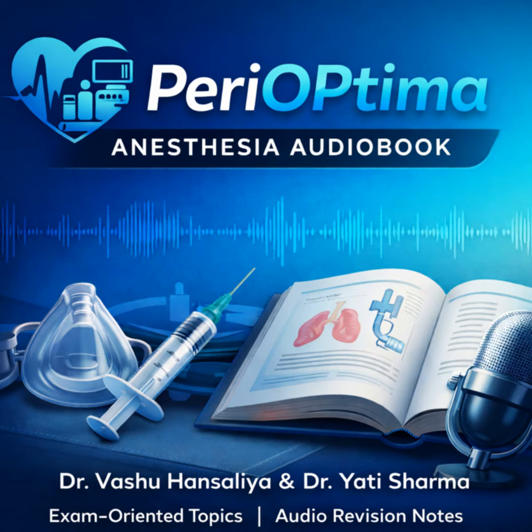That works, but you need to explain the trade-off. This is the fundamental rule of ultrasound physics. Miller hammers this home. Frequency is inversely related to penetration. Okay, let me try to frame this for the answer. High frequency means short wavelengths. Short wavelengths give you amazing detail, high resolution, but they run out of energy fast. They can't go deep.